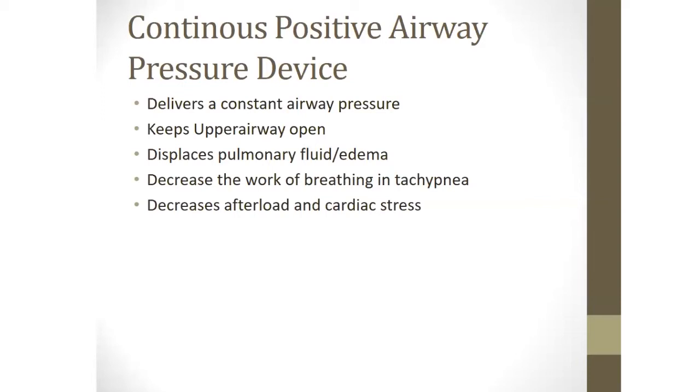It displaces the pulmonary fluid or edema, decreases the work of breathing and tachypnea, and it also decreases the afterload, helping the cardiac stress. So the main use of CPAP is in those with a problem of oxygenation, not ventilation, not CO2. These patients will benefit from CPAP.